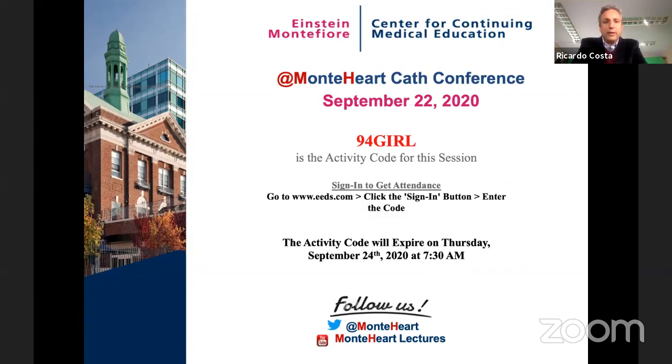So in a situation where you have crush stenting, which is more prone to deformation and distortion of the struts according to the technique applied, you are also more likely to have events like stent thrombosis. Remember the study from Angela Hoye, by the time the stent thrombosis with the classic crush stenting was around 4.5%.